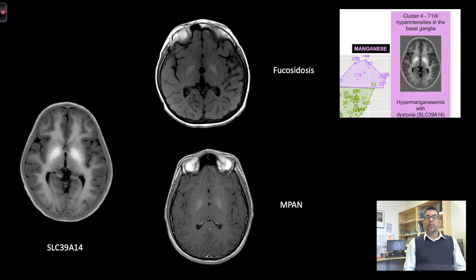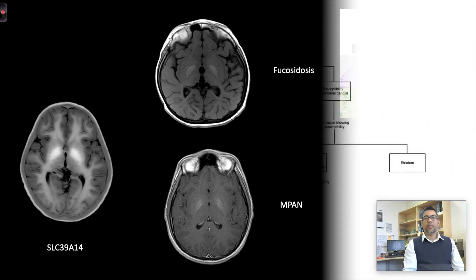Children who had manganese deposition in the brain due to genetically determined transporterpathies had a very bright T1-weighted signal in the basal ganglia, but also elsewhere in the brain, and you will see that this is contrasted with the lesser intensity and signal seen in some other disorders.